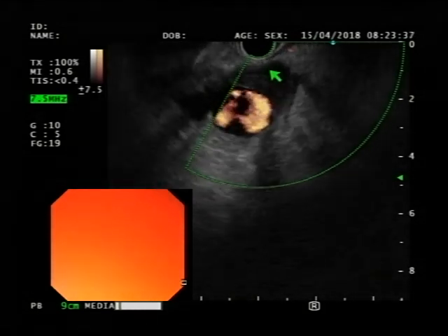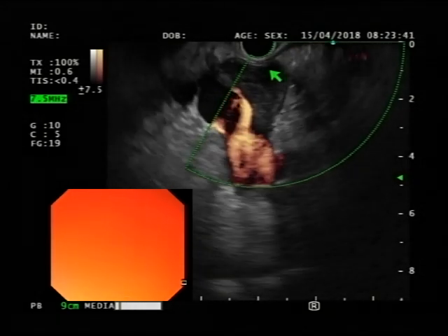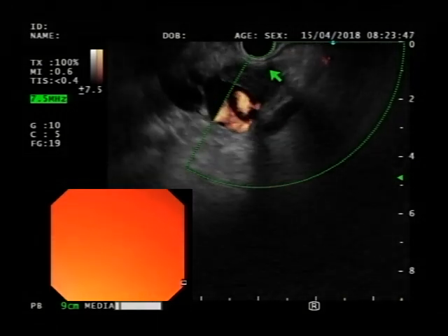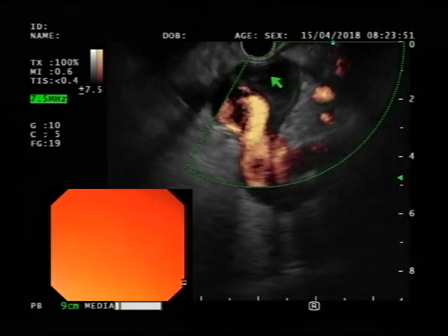And somebody just mentioned that she had varices as well. Yes. Okay, so this looks really more like a clot in the splenic and portal vein to me. If you want, I can do an FNA, but it may be just all blood in there.